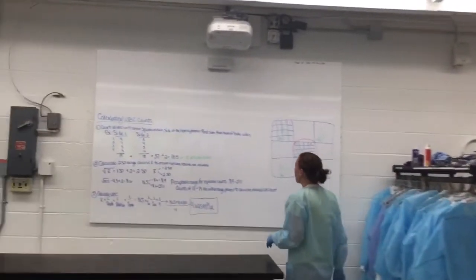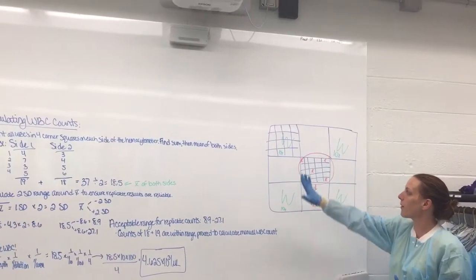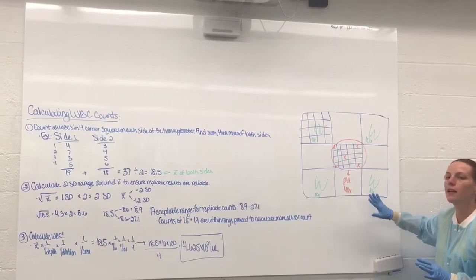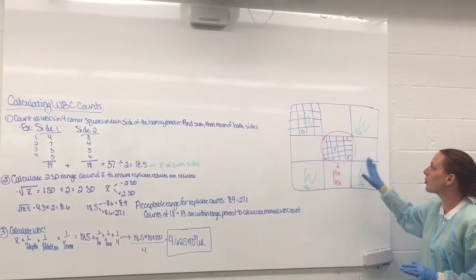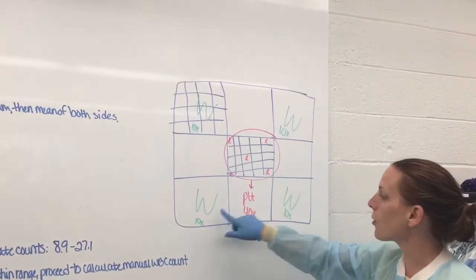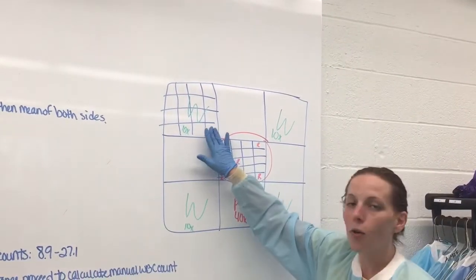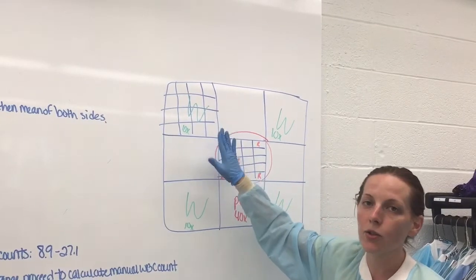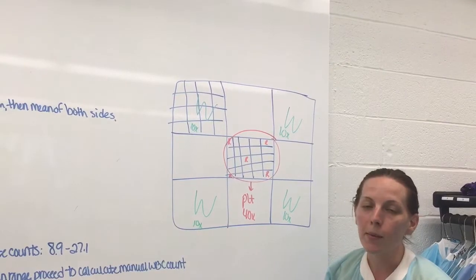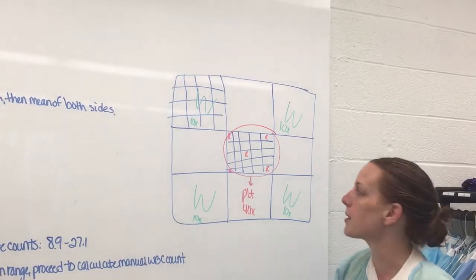Okay, so when you put your hemocytometer up on your microscopes, this is what the grid will look like. There will obviously be more lines in this, but I'm trying to show you the basic idea. Each hemocytometer is going to be a grid of 9 squares. When we do white blood cell counts, we are counting the 4 large corner squares on both side A and on side B. When we count a WBC count, we always do it on 10x. So we will not be going to 40x at any point in this procedure except to confirm that what we see is not junk, it's actually a white blood cell.